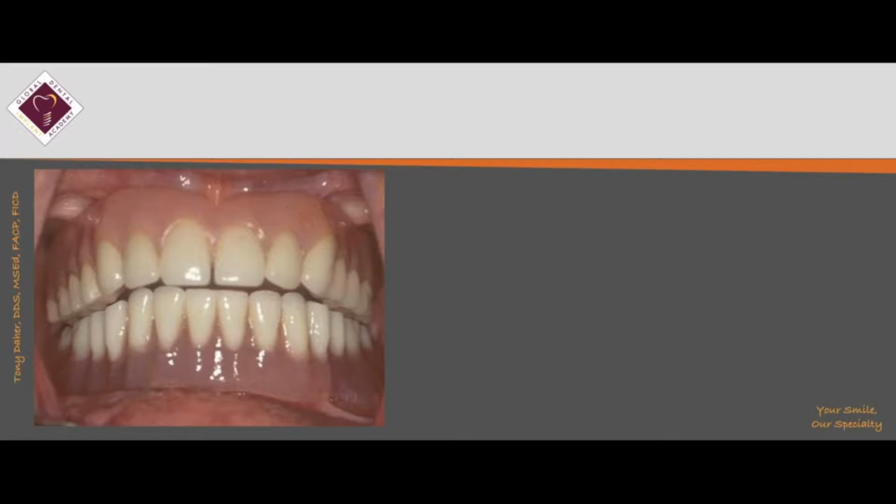She did that, and when you look at the slide, on the left side the teeth start to be in contact, but not on the right side. Then I told her to squeeze, and suddenly the lower denture lifted up from the attachment and started hitting the opposing denture.